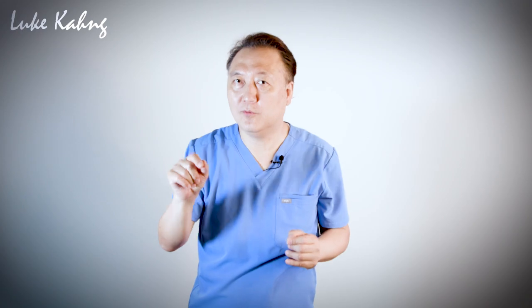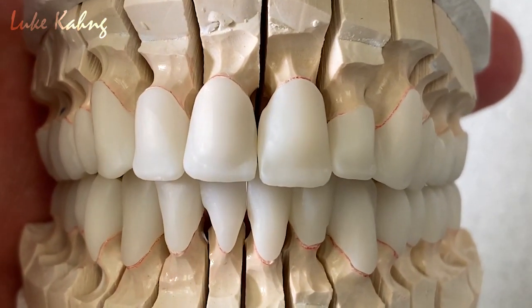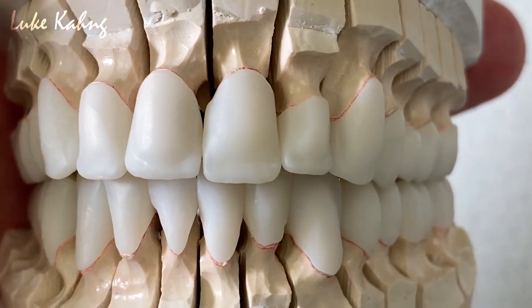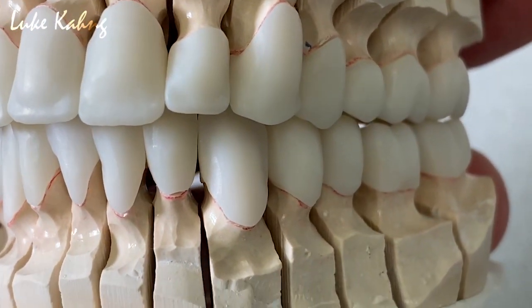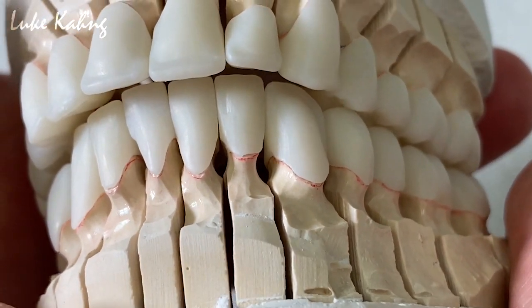So I have to grind down like that. Anyway, after that we sinter and we put it back to the model, and then we check the whole frame design, and also we add the porcelain layer and then finish them up, okay, to get all the proximal contact. And then I can show you right now what it looks like, okay? This is now the 28 teeth designed. After you see, the whole design is very accurate.